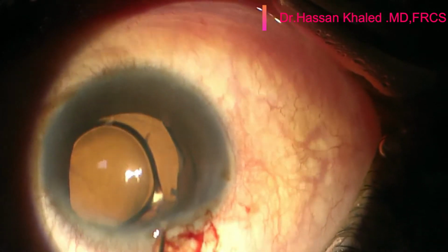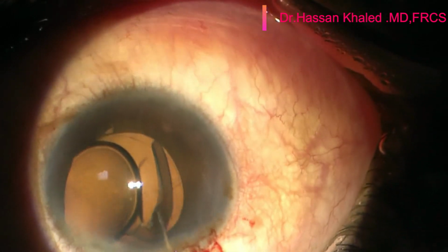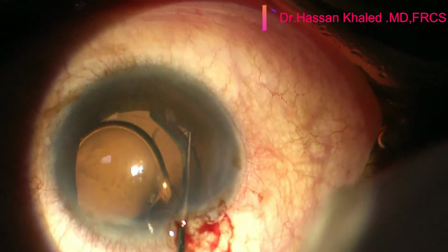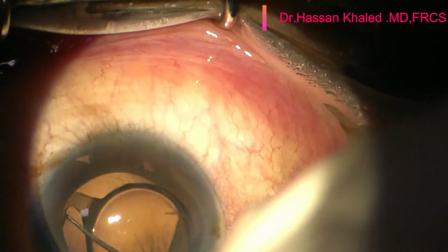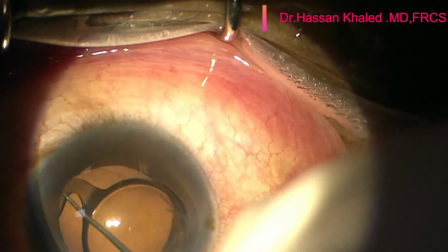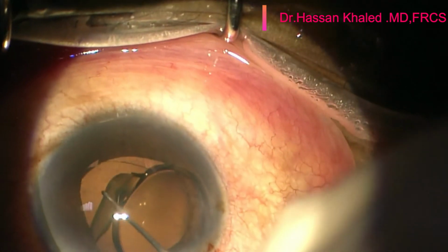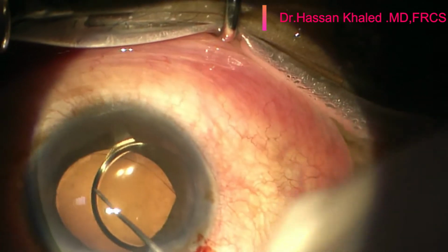As you can see in this video, now the first haptic is out from the capsular fornix on this side, then the second haptic of the IOL is also out of the capsular bag fornix. Now both the haptic and the optic are in the anterior chamber.